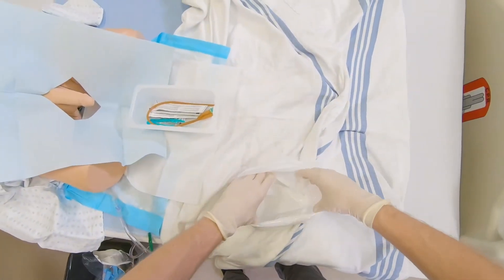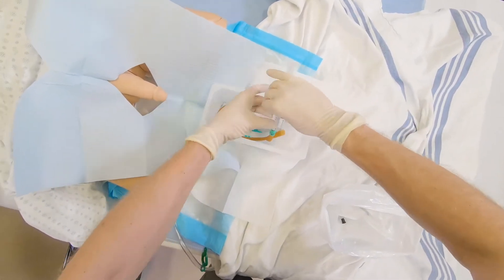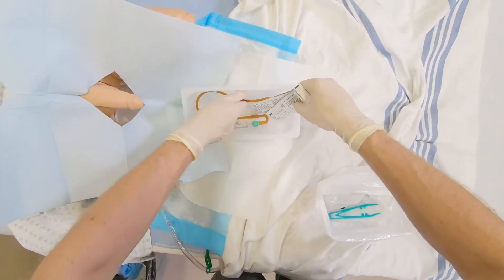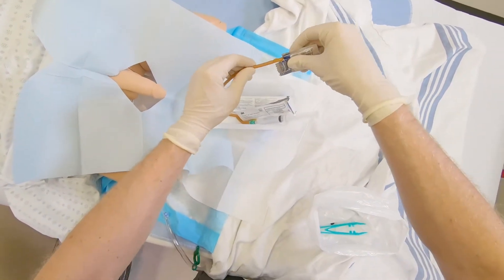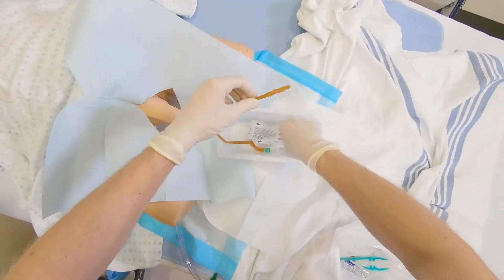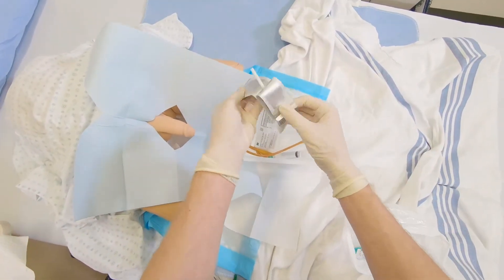Insert included 10 ml syringe filled with sterile water onto balloon inflation port. Next, generously lubricate first few centimeters of catheter tip. Open packages of cleansing swabs.